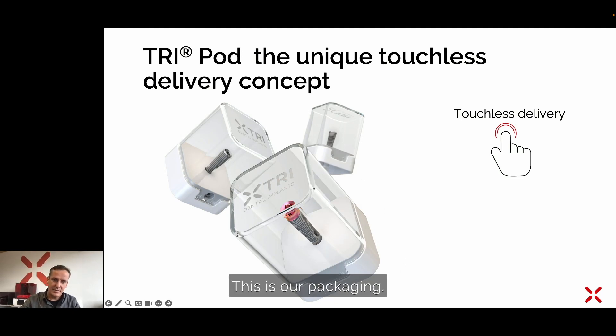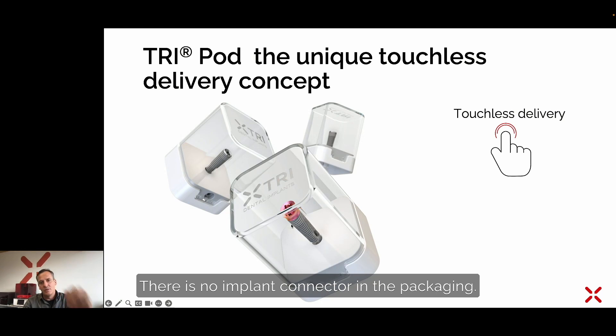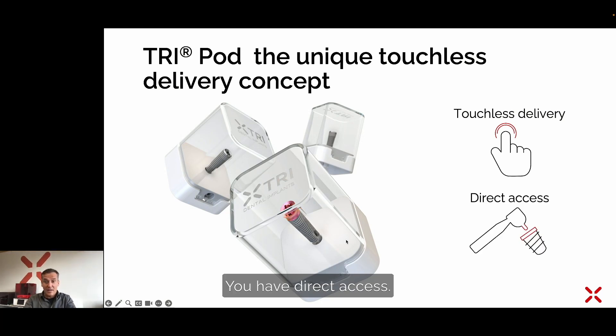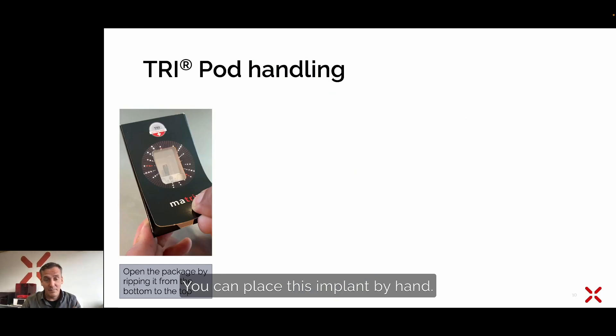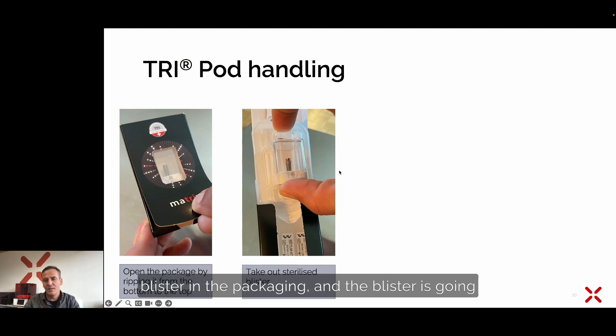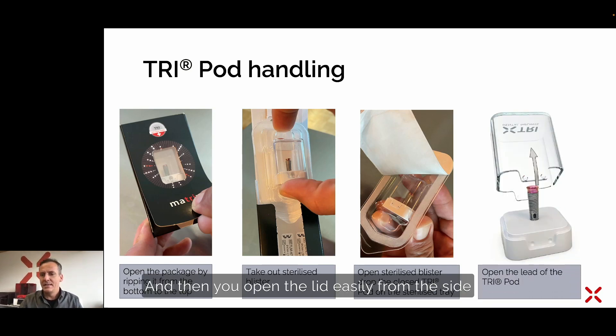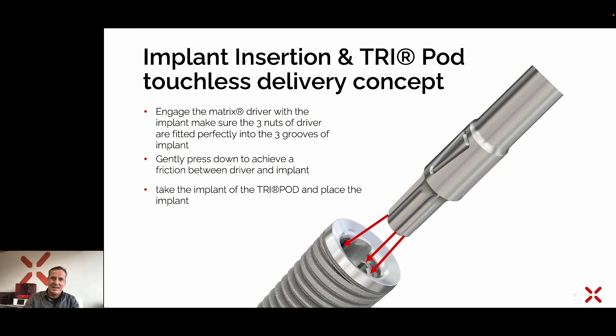Continuing with the TRI pod — the unique touchless delivery concept. You can see the packaging: the TRI pod includes the implant and there is no implant connector in the packaging. You have direct access and can place this implant by hand, with your handpiece, or with your torque control. To open the TRI pod, it is always packed in a black box in a carton. Take the lid from below and rip it open. Then take out the sterilized blister. The blister is opened from the triangle below. You open the blister and drop the sterilized TRI pod onto the sterilized surgical plate, then open the lid easily from the side — and you are ready to place the matrix implant.